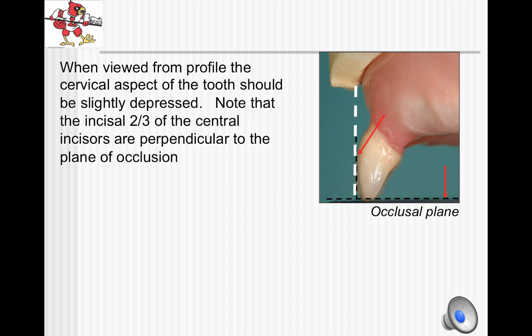In this particular patient, appropriate lip support was achieved by placing the labial surface of the central incisors on a curve coinciding with the point 8 millimeters anterior to the incisive papilla. This may vary, and in many patients, the incisors project more anteriorly, especially in those with severe resorption of the premaxilla.